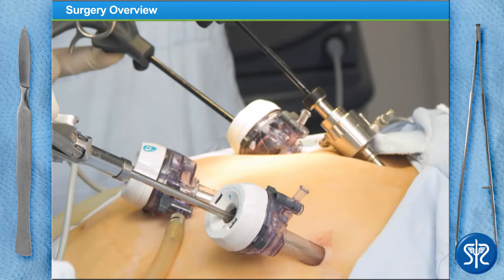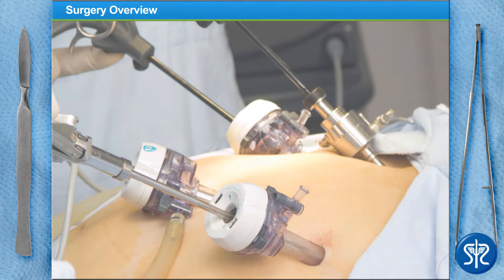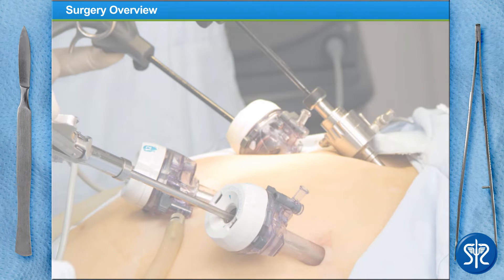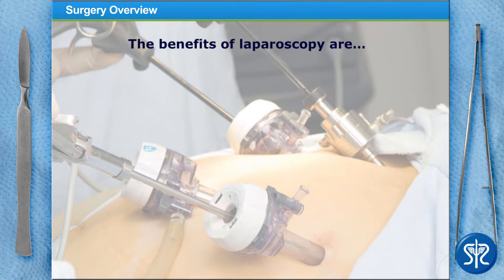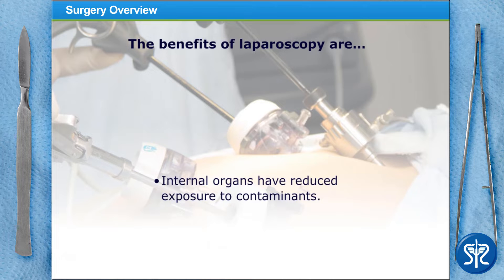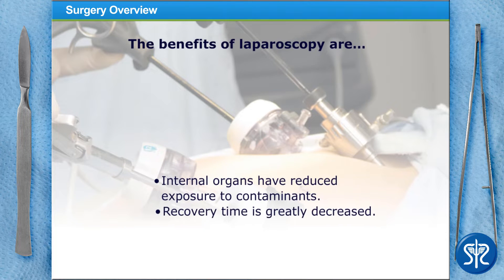Today we'll be using a minimally invasive technique called laparoscopy to remove our patient's appendix. Laparoscopy reduces the exposure of internal organs to contaminants, shortens recovery time, and results in less post-operative scarring.